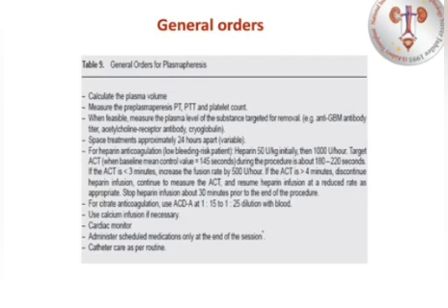So it's wise to give them post-session so as not to lose their effect. Of course, catheter care should be done routinely to avoid any kind of infection, and make sure that you close the catheter in a proper way to avoid clotting of the catheter in the future.